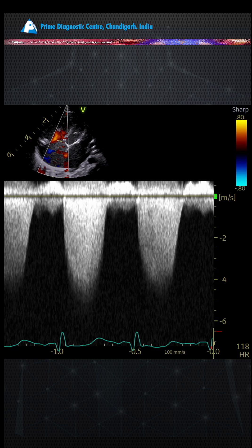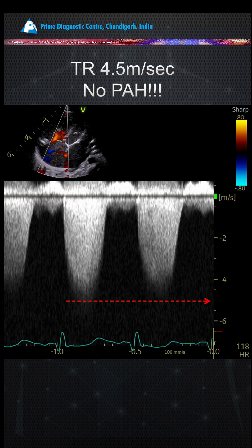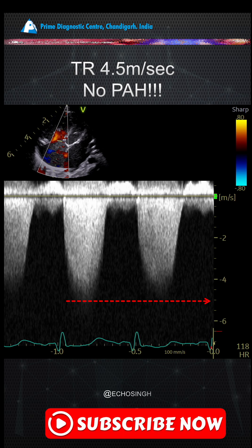Here we see tricuspid regurgitation and you can clearly see the velocity is crossing 4 meters per second. Would you be surprised if I told you there is no pulmonary artery hypertension? Really — a 4.5 meter per second TR velocity with no pulmonary hypertension? Yes, that is what I am going to discuss today.